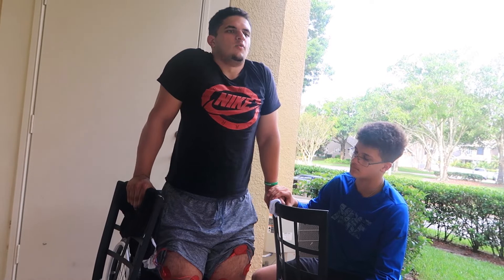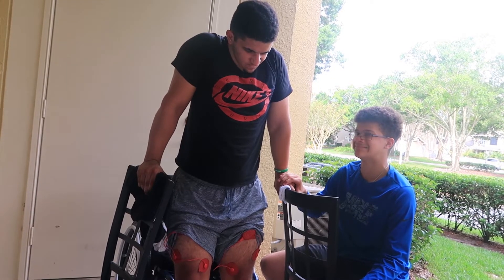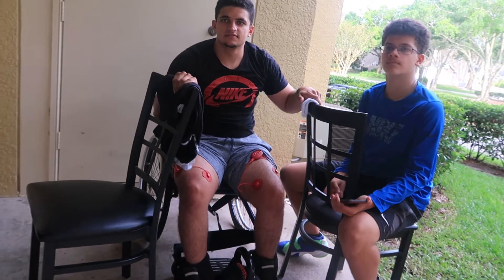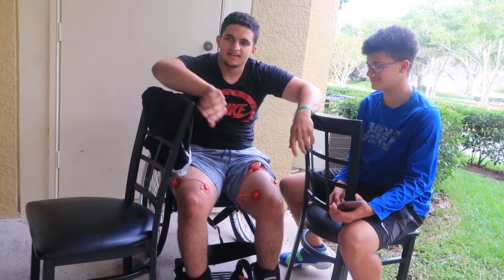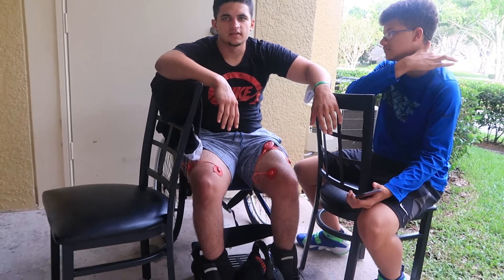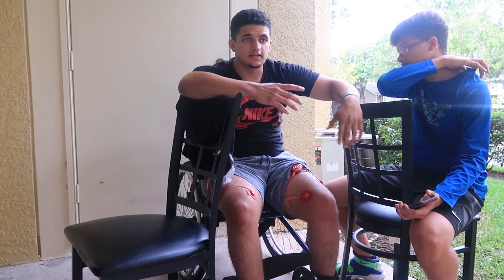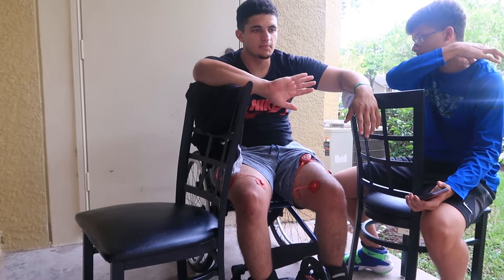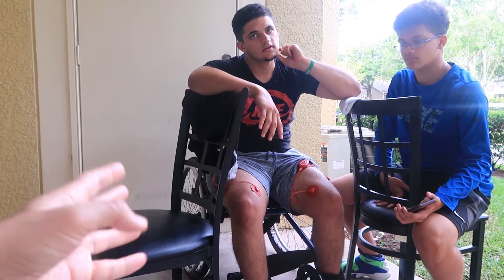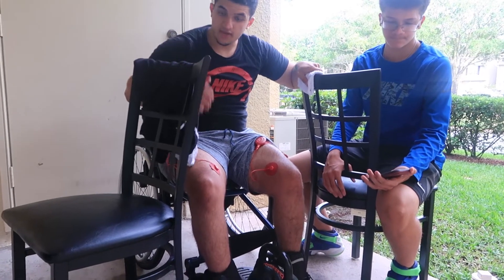So yeah, it's not right though — it's like your legs are slanted. Yeah, you're still bending at the hips. Exactly. I guess I need to think of something — until I get a standing frame or some leg brace or something to push my back in while I'm doing this. That's why I asked about the standing frame, because that's what I was seeing. So we've got to figure that out.